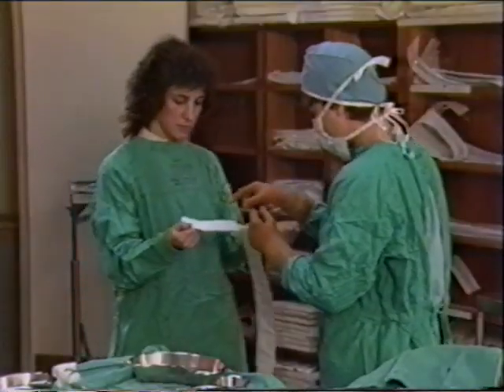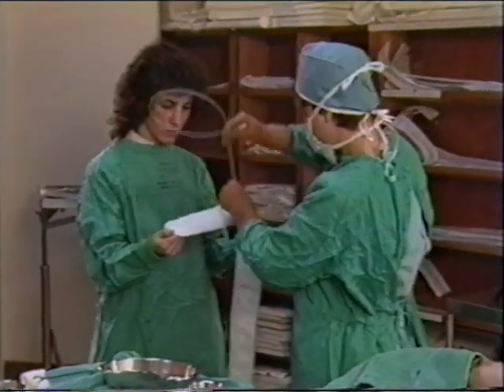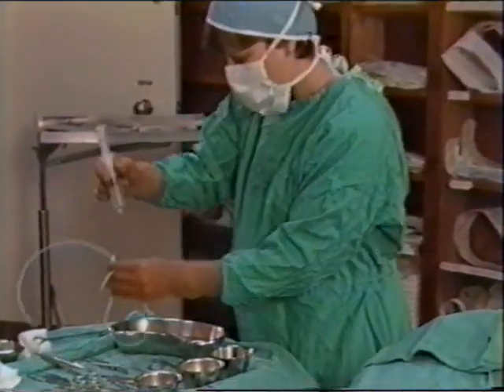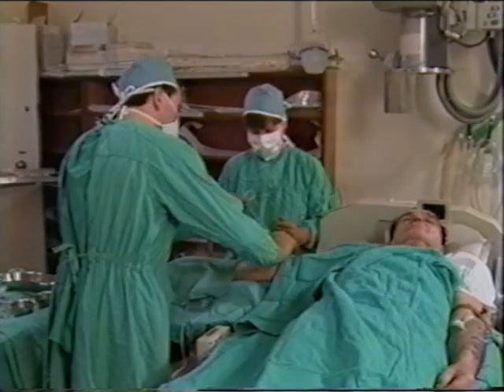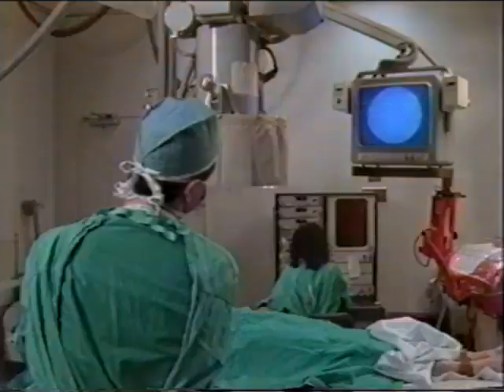Through this prepared area, your cardiologist will pass the catheter. The catheter is about the diameter of a thin straw. One end of the catheter will be placed in a blood vessel. The other end of the catheter may be attached to instruments which monitor your blood pressure and heartbeat.